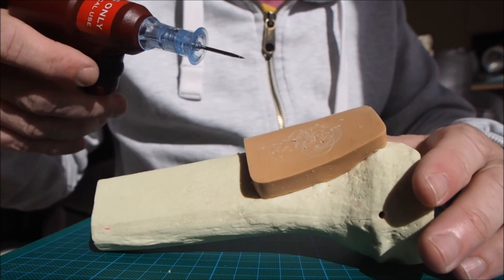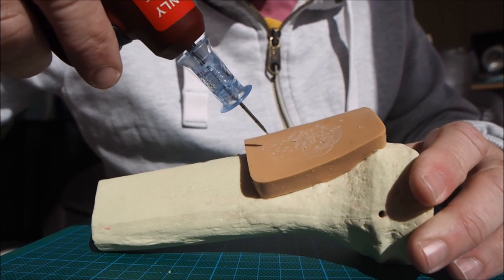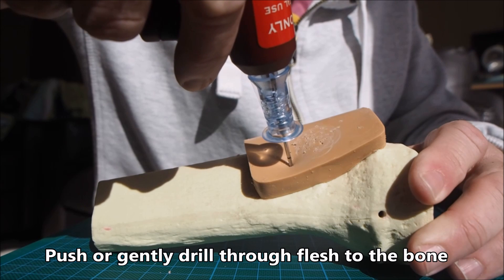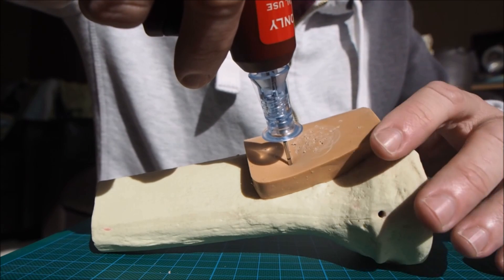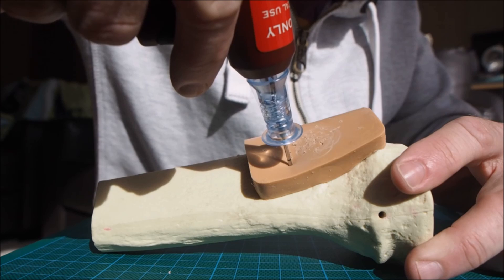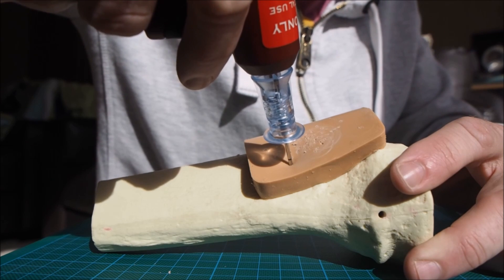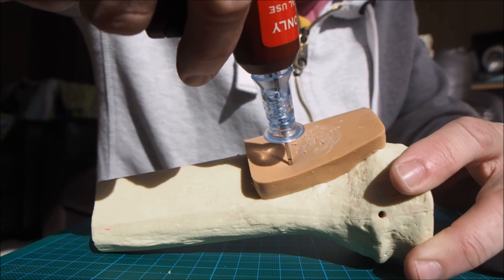I'm not going to go for the site we've chosen simply because a lot of other people have already been there and it's made a bit of a mess, so I'll choose somewhere down here. You need to locate the needle 90 degrees to the skin, and you can actually push it straight through until you feel bone resistance. You need to make sure that you've got 5mm of needle between the skin and the hub. The black lines will help you identify that. If you can't see any black lines, you're in too far. If there's not enough length to go into the bone, you need to pull out and choose a bigger needle. But this is looking good so far, so I'm basically ready to pull the trigger, push firmly, listen for a change in tone, and stop drilling when I hear that change in tone.